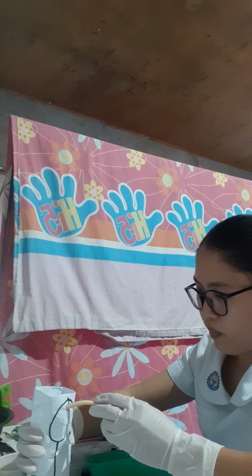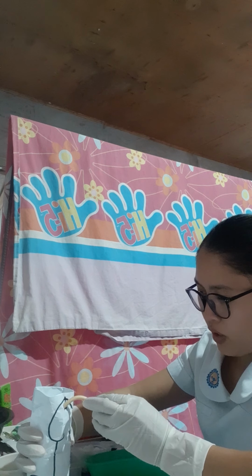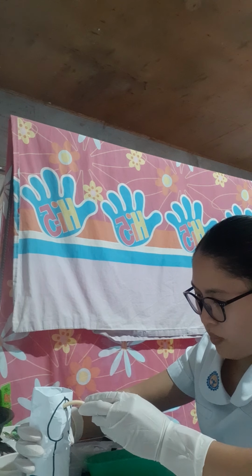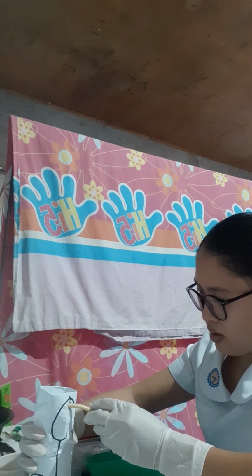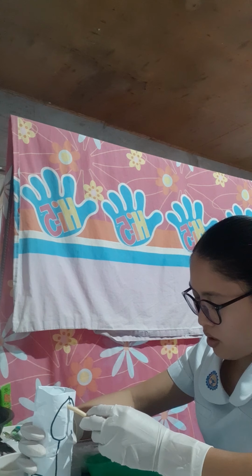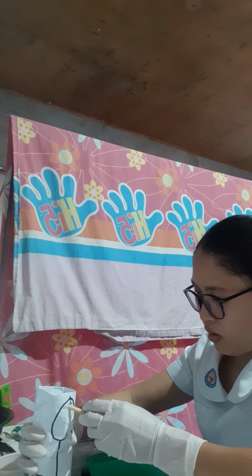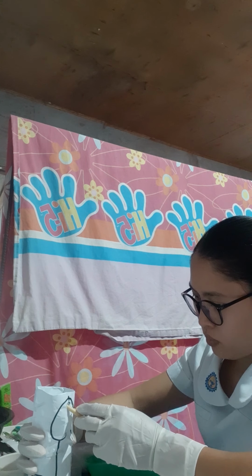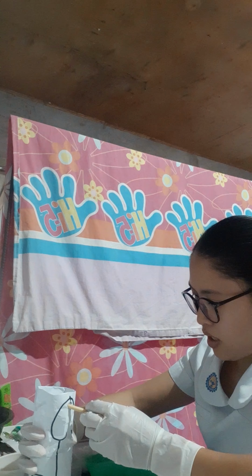through the meatus. Advance the catheter 17.5 to 22.5 centimeters, which is 7 to 9 inches in an adult, and 5 to 7.5 centimeters, 2 to 3 inches in a young child, until urine flows out of the catheter's end.